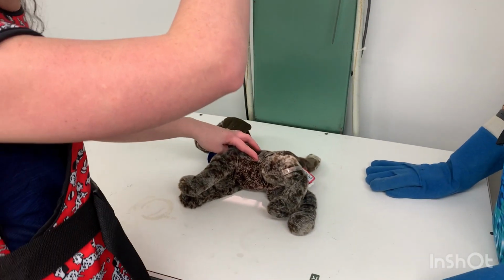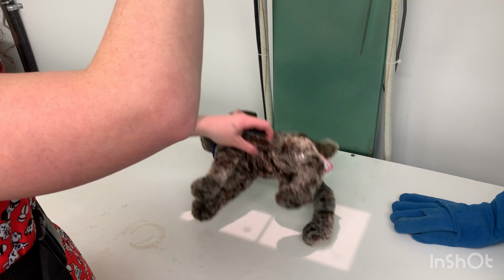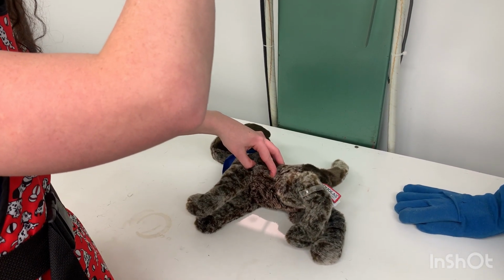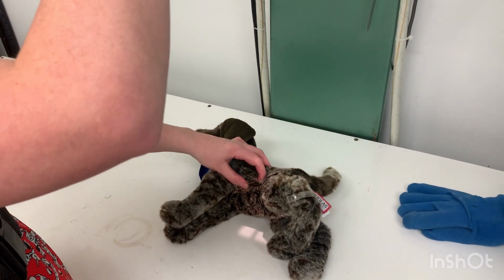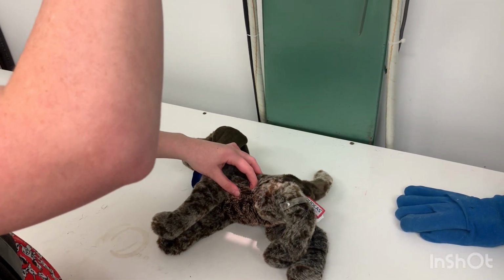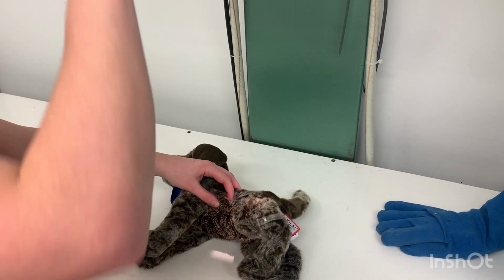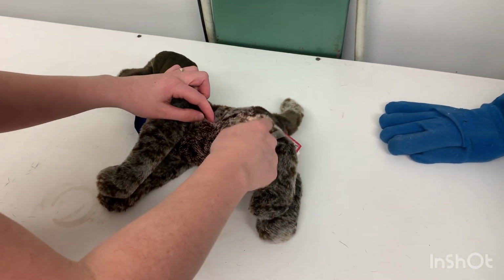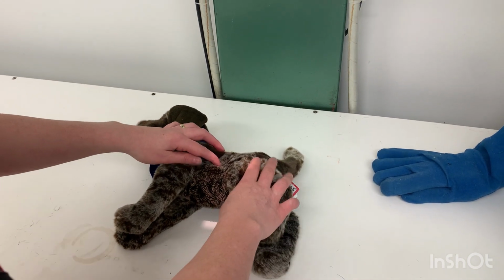So this is how you would adjust your collimation. Now it will only go, as you can see here, it will only go so small. So that's about as small as I can get it to go. Or no, it will go smaller, sorry, ignore me. But now we can see here, that's where the collimation starts. Collimation is ending right about here. So that's about where we need for the collimation field.